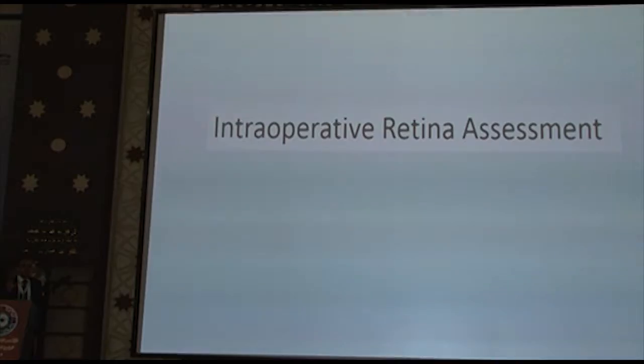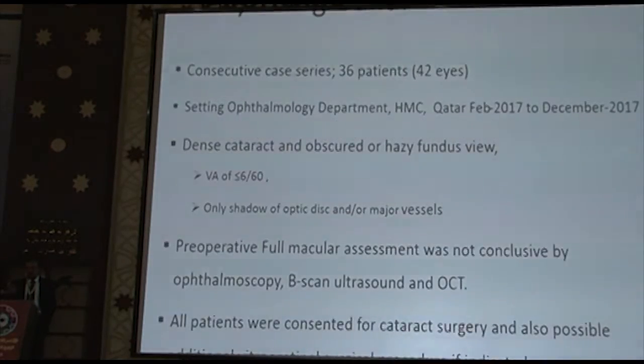So the best thing to do, if you cannot assess the retina before doing the cataract surgery, is to do it during the surgery, intraoperatively. This is the background of the study. I had 42 eyes in 36 patients. This was done in Qatar when I was working there.